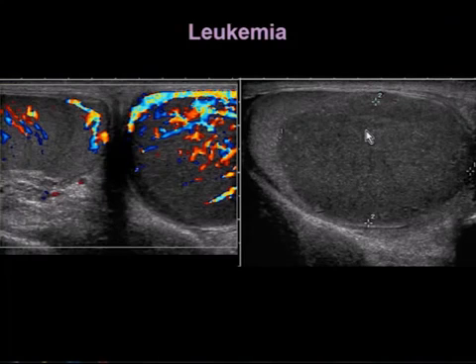So this patient has leukemia, and the left testicle was enlarged and filled with this hypoechoic region in the mid and lower pole. This represented leukemic infiltration of that part. Notice that the left testicle on transverse view appears larger than the right testicle, and also notice that the involved portion, the leukemic portion, is hypervascular compared to the normal right side.